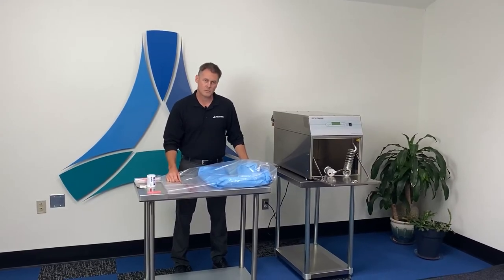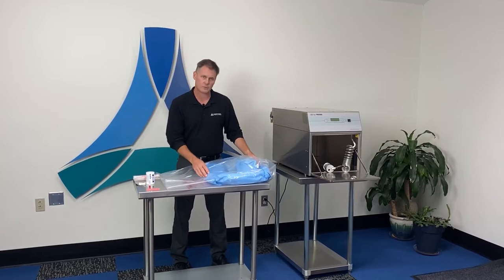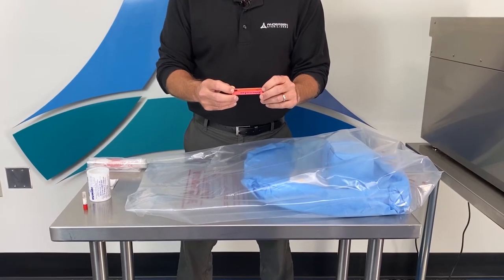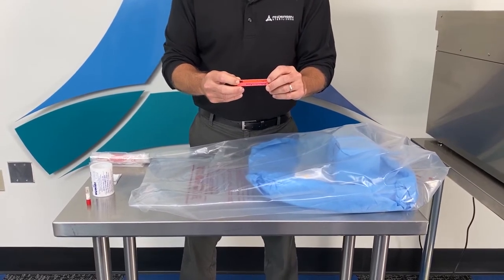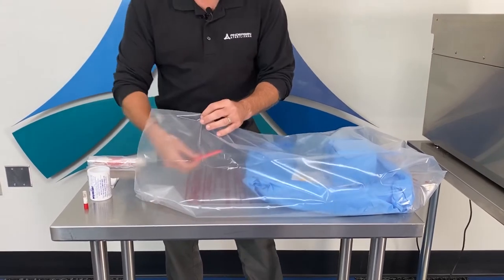Now we're going to place our consumables inside of the sterilization liner bag. For demonstration purposes we've already pre-loaded this bag for the items that we're going to sterilize. The first item you'll place into the sterilization liner bag is your AN87 dosimeter. We recommend placing this dosimeter in the least accessible place in the load, which in this case is between two items in the bag.